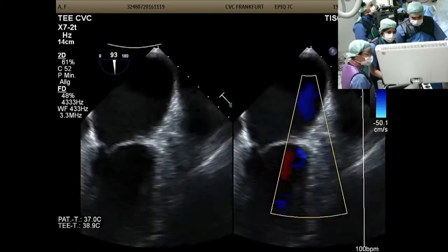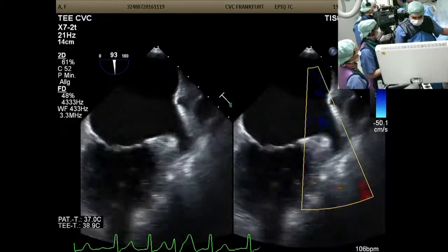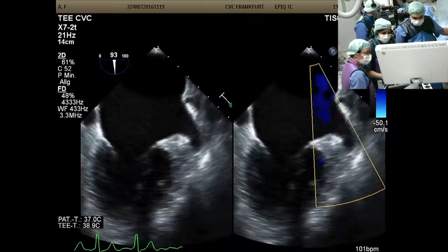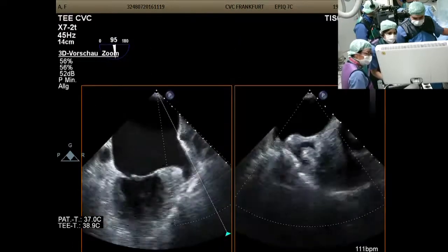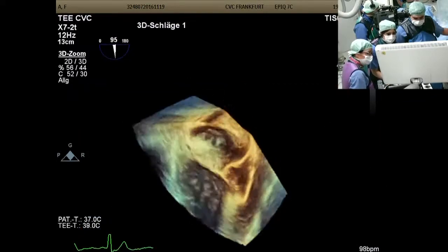It's almost closed, isn't it? It is. It's a big, massive mouth. We are done, no? Tiny, yeah. My point was going to be that if ever you could stratify a particular appendage into a high risk or a low risk thrombotic category, not sure how you'd describe this.